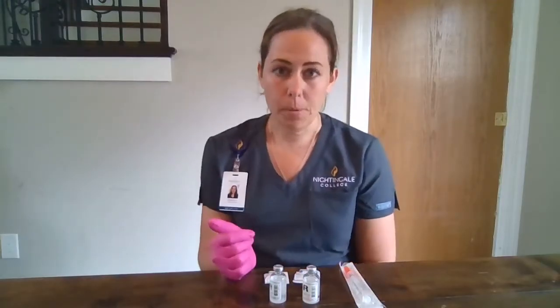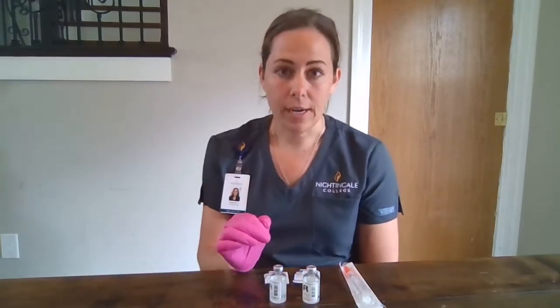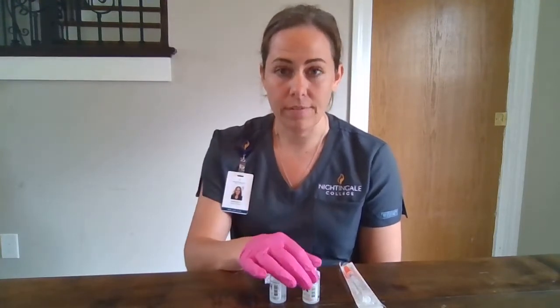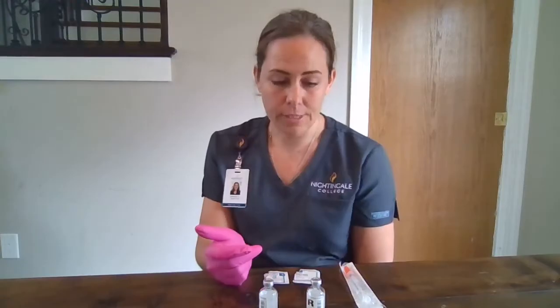I'm going to pull up your order in the MAR. I'm going to verify again our medications against our MAR. I'm going to have a fellow nurse come in and verify our drug calculations. Today your doctor has ordered four units of regular insulin and eight units of NPH, so that's going to give us 12 units total volume. I'll have my nurse verify those numbers.